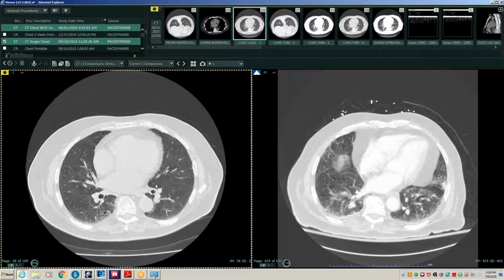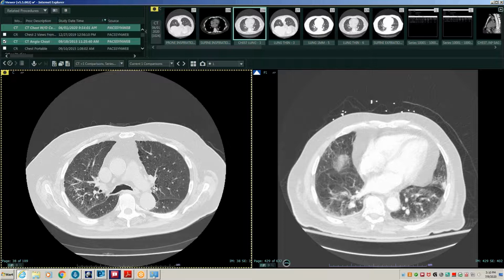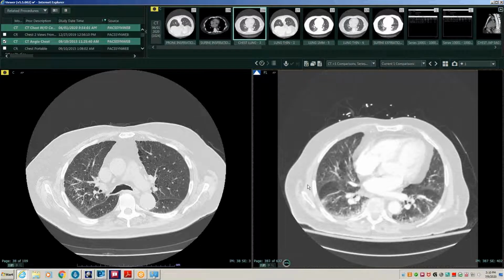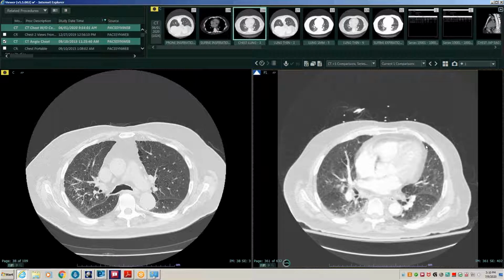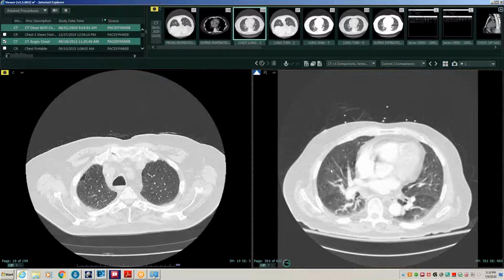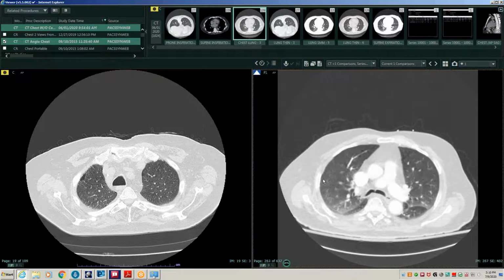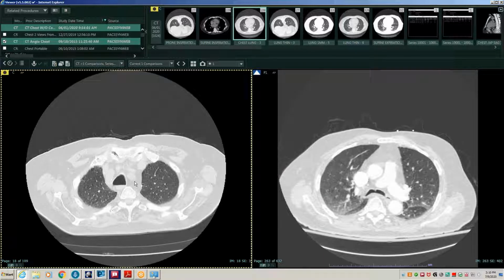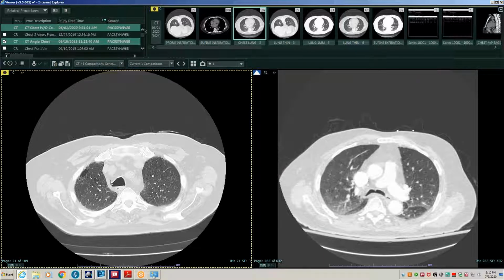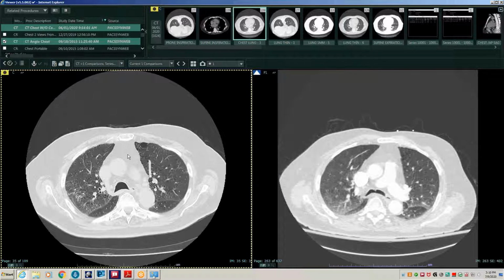So this is a gentleman in his 80s who carries a diagnosis of Sjögren's disease. And he has this CT, this is from 5 years ago, on the right, and on the left is a current CT. Unfortunately, this last CT was a CTPA. There's quite a bit of motion affecting the visualization of the lung parenchyma. And he had a CT in January at an outside hospital that looks virtually identical to the current one. At that point, he was diagnosed with LIP and put on mycophenolate.